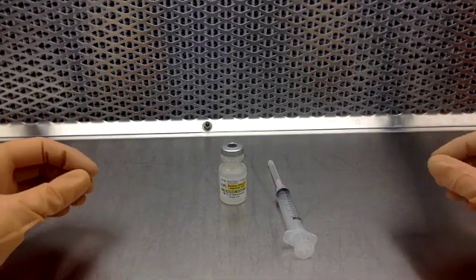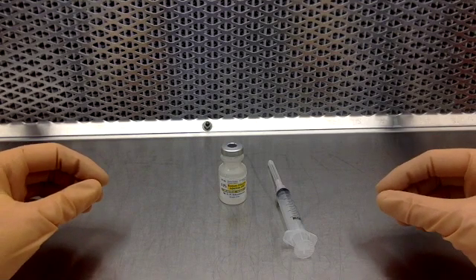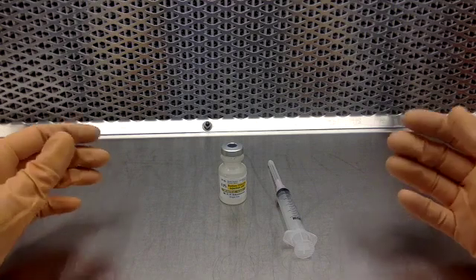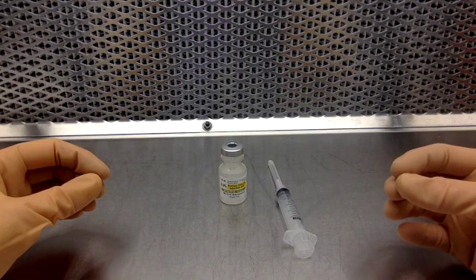This video is going to go over the proper procedures for insertion into a rubber septum using an 18 gauge standard needle as well as an 18 gauge blunt fill needle.